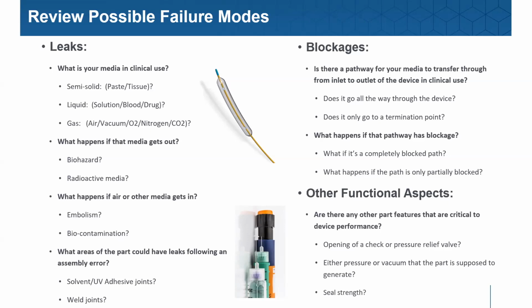Now, this most of the time happens in the form of bag testing, where it's typically a radio frequency heat sealed bag made of two layers of material, and you need to perhaps challenge this to make sure that the seal strength is what you were expecting. Yeah. So all these questions come in.